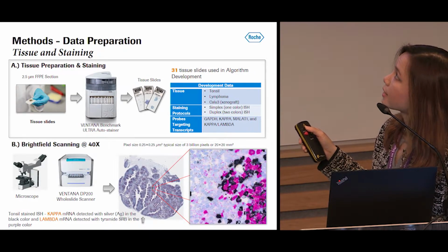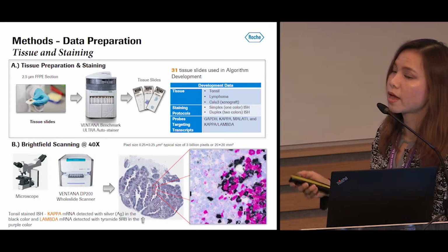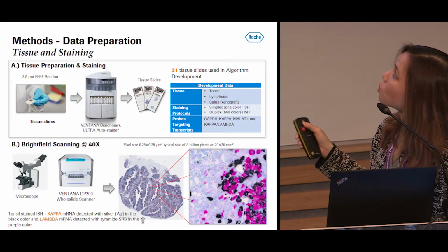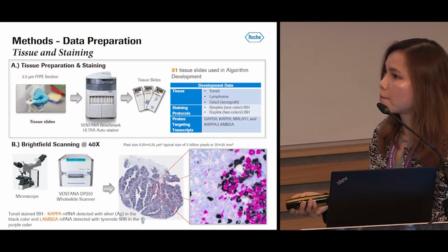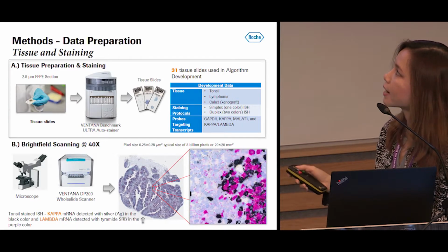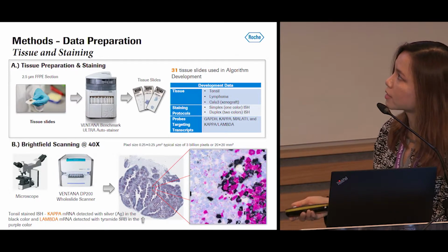The slides have been stained using the simplex and duplex ISH protocol with this probe of the study. The slides were captured using a camera mounted on the microscope, and also using a whole slide scanner, as shown here in a sample whole slide image.